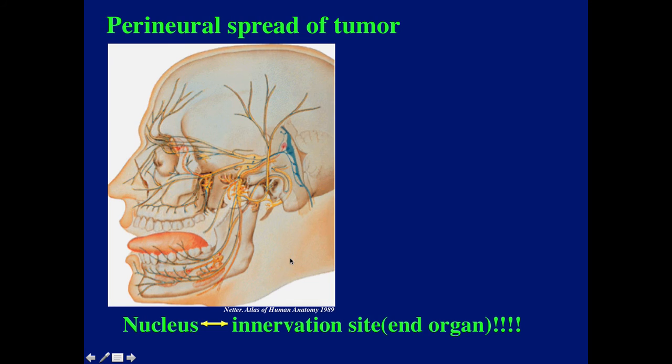And one thing is, you've got to know the full course of the nerve, all the way from the nucleus to the innervation site, because that's how you will pick up these very difficult and important lesions.